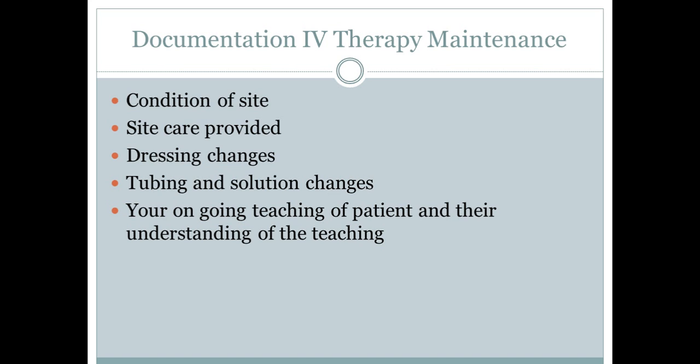And for example, a facility might have it at 6, 2, and 10. Definitely those are times you're going to be looking at the sites, but it's still good just to keep an eyeball on that in between. Now, obviously, if they do have IV fluid running continuously, it is good standard practice to be looking at that IV site every hour.